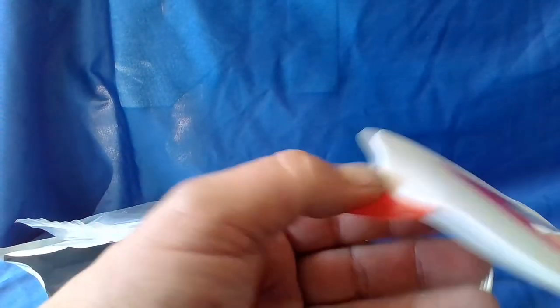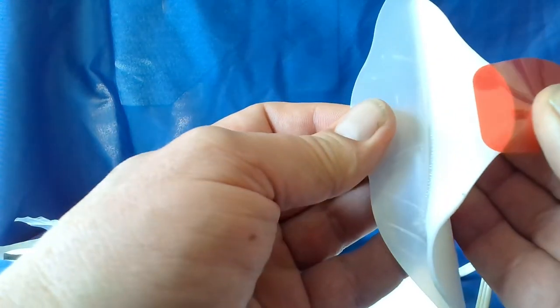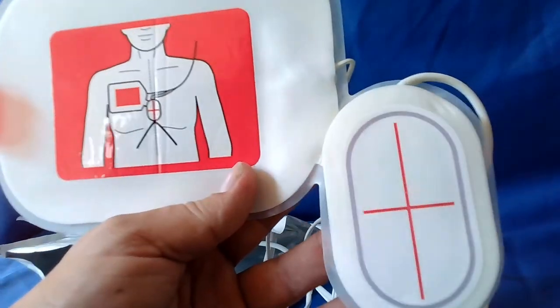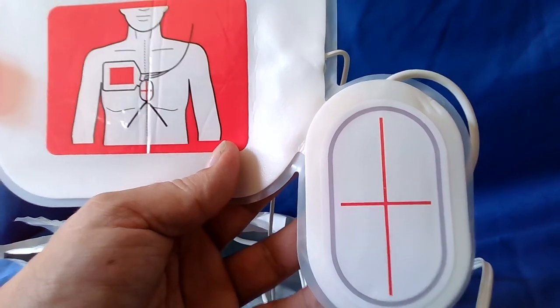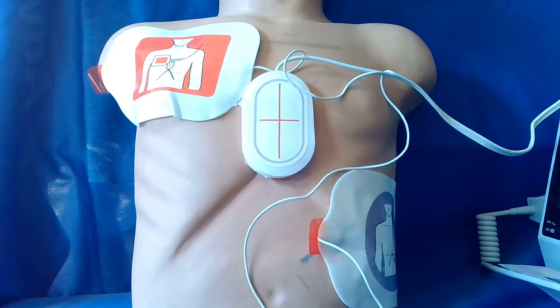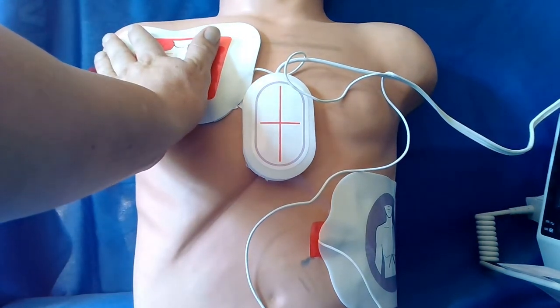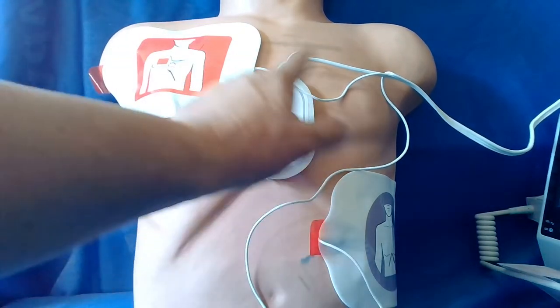Place this onto the patient. We hold the red tab in one hand and we simply peel off and then place it onto our patient. How do we place it onto the patient? Another good question. As you can see, we have placed our apex pad on the left hand side of the patient. We've placed the right hand or the sternum pad at the top. And that is centered by your puck.